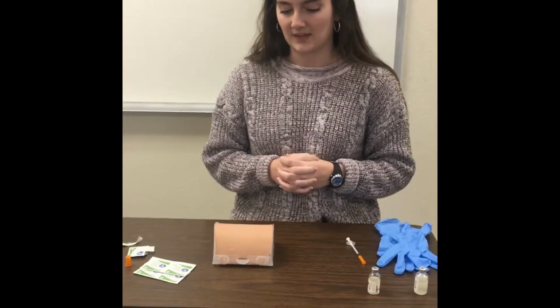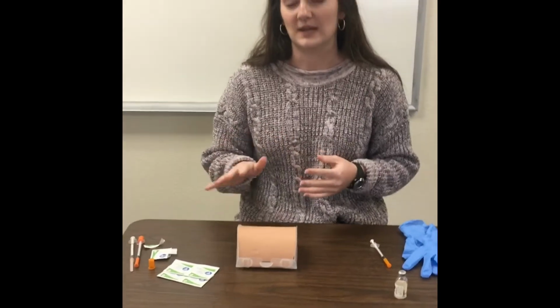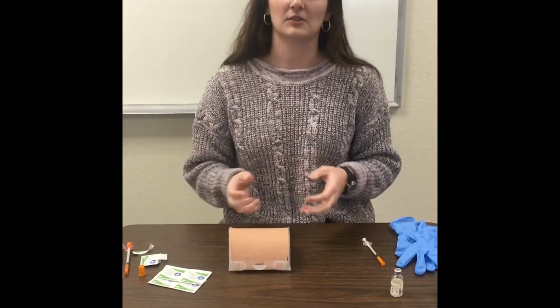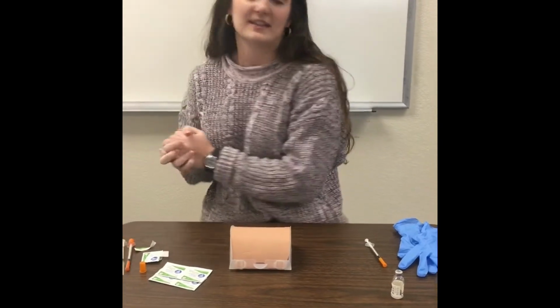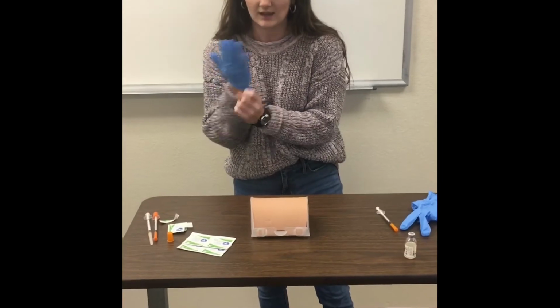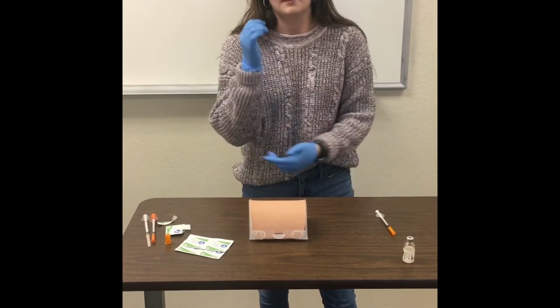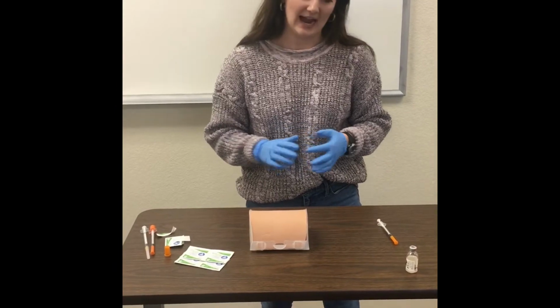After that, I'm going to go into the patient's room. I'm going to introduce myself, ask 2 patient identifiers, ask about any allergies, make sure they have food, and check their glucose levels to see if I can give this insulin or not. Then I'll wash my hands and put on my gloves. We're going to be giving this sub-Q insulin injection in the umbilicus, but the other places are the back of the arm, outer thigh, love handles, and the back.